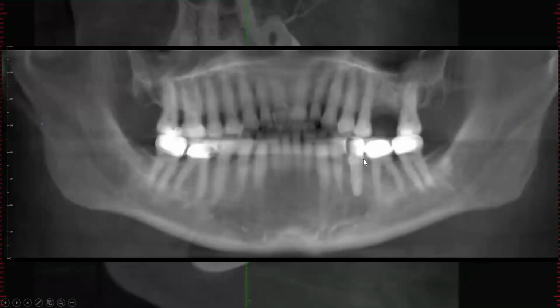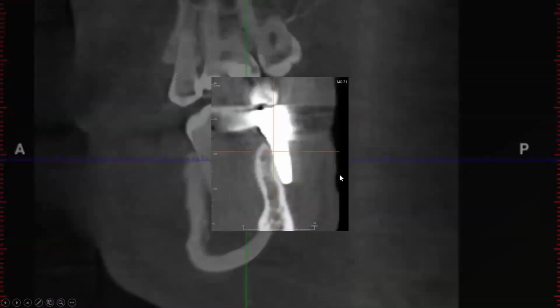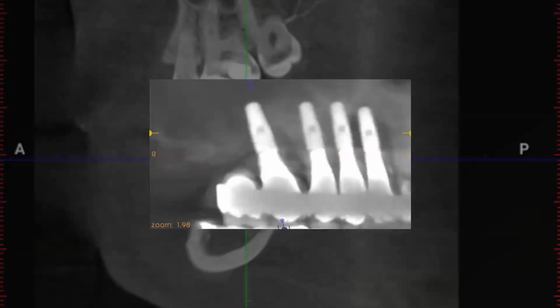This case looks great, right? Right in the middle of the teeth, plenty of bone around it. But this one's buccal to the bone. So this is what we call soft tissue integrated, where it's just sitting in soft tissue. I mean, it may have been some of the threads of the implant just barely integrated into the bone here. And so, just a few cases.